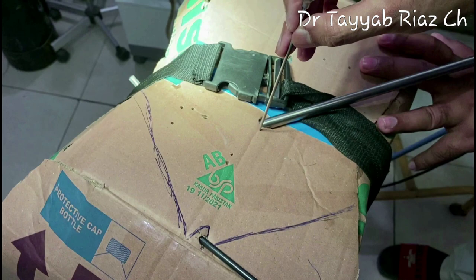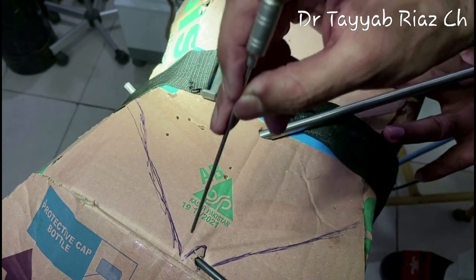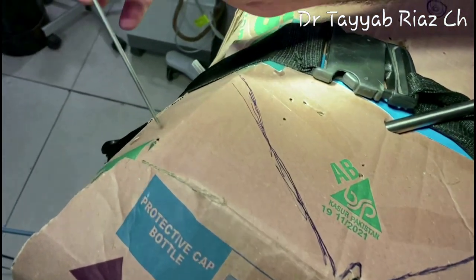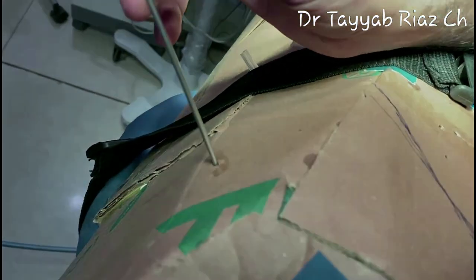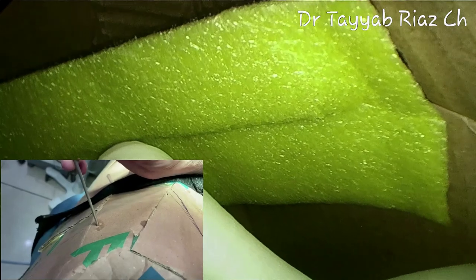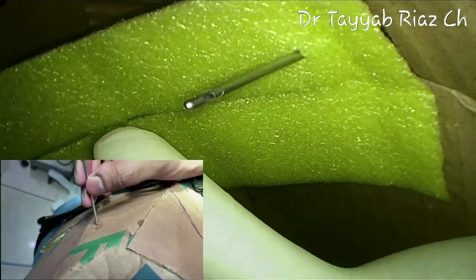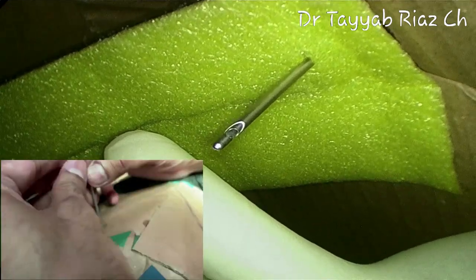Kindly visit that link. This is a 10 mm optical trocar in the inferior umbilical crease. This is a 5 mm trocar in the suprapubic region. And here I am going to insert the Veress needle at a point in the right iliac fossa where the maximum handling of the appendix can be performed.